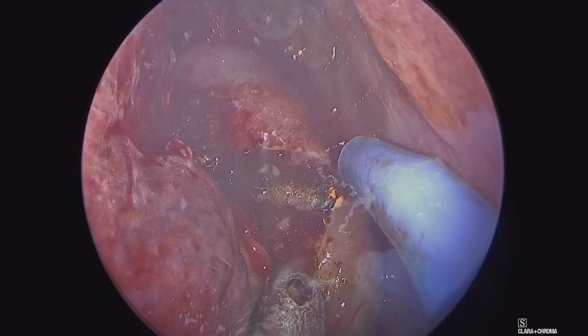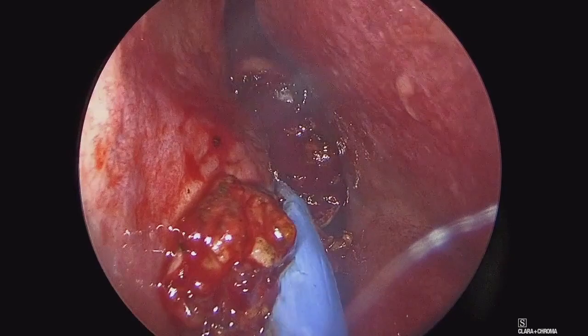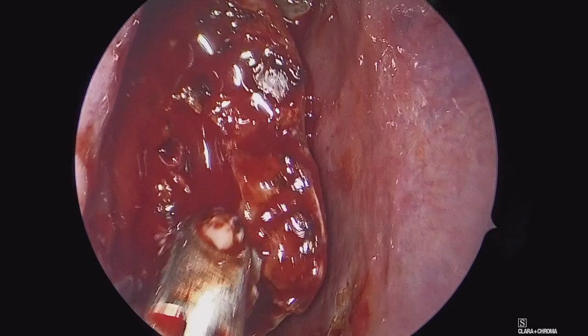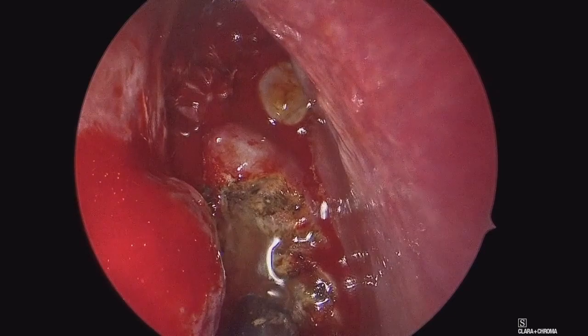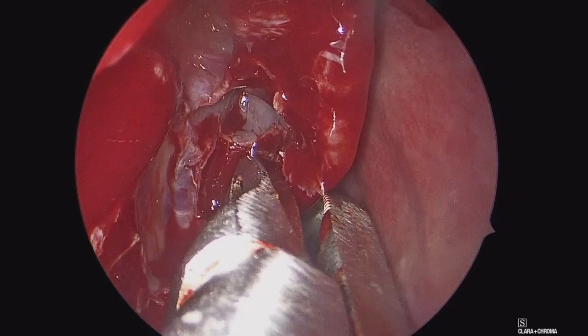Although this tumor has a classic appearance of a JNA, I do typically like to get pathologic diagnosis intraoperatively to confirm it. There have been cases, including one I had to take care of, where patients were assumed to have a JNA at outside facilities and it came back as a different malignancy requiring significantly more surgery. Here we are taking some additional biopsies for permanent pathology. We're reassured there's not significant tumor bleeding as our preoperative embolization was excellent. What I like to do in these cases is debulk some of the tumor and get access to the sinuses around it, quickly establishing a nasopharyngeal port for egressive blood.